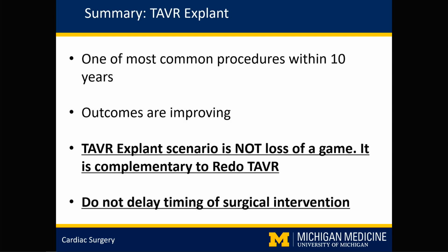But I think we had to just show the data first, and then, yeah. So by the way, I also do it the way you do. I transect the aorta about a centimeter above the edge of the valve.